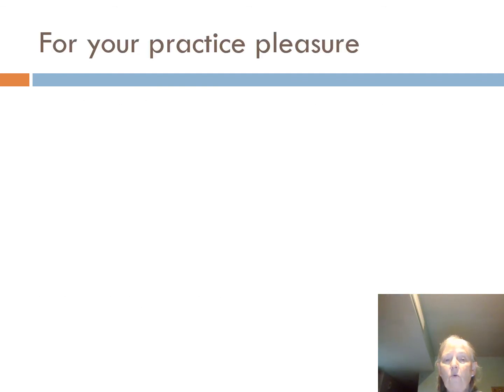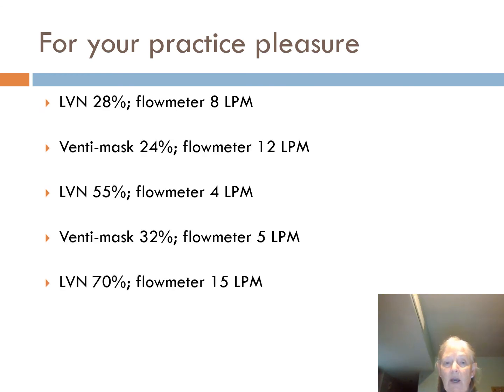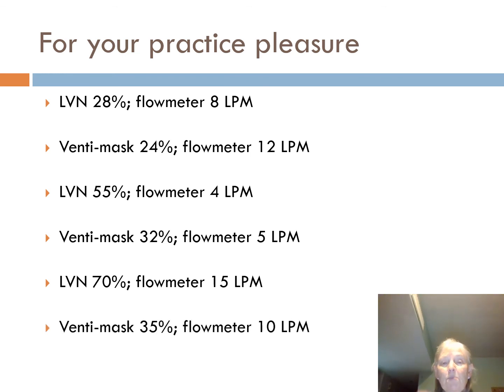And then this is slide 34, where you get to practice your high flow, okay? And what you're looking for at this point is how much total flow is being delivered to your patient. So remember, you're going to have to figure out the ratio and then multiply that ratio after adding it together times the flow meter. If you have a problem with these, please let me know. I am going to post a worksheet for you to be able to practice these, but this is your introduction to it, so it should work out fairly well for you.